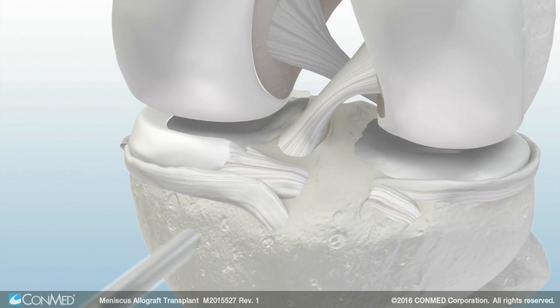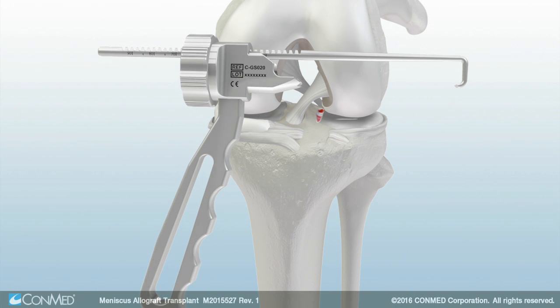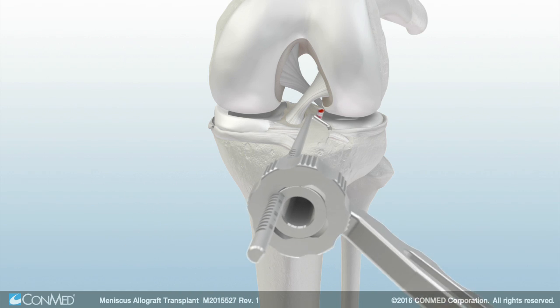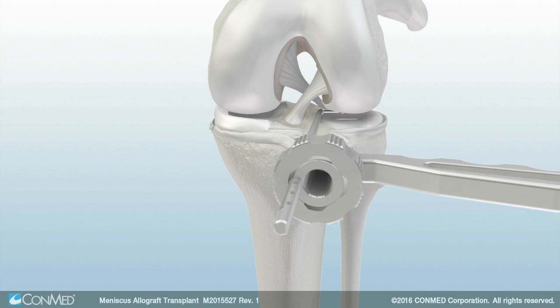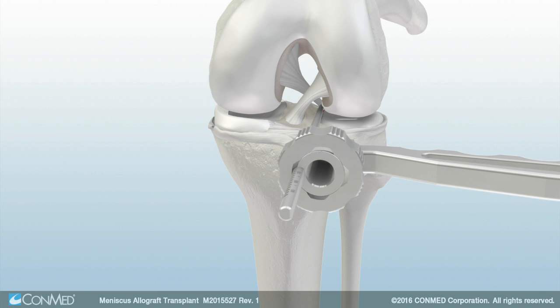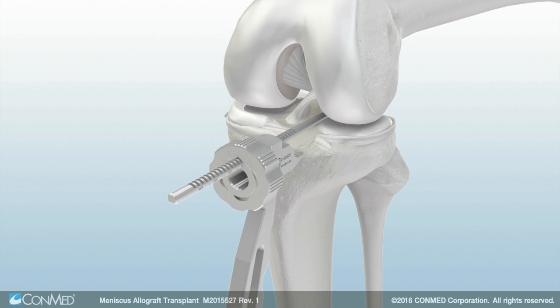Starting at the anterior horn, burr toward the posterior horn to create a shallow trough level with the tibial plateau. Then insert the drill guide into the incision vertically. Once inside the joint, rotate the guide horizontally to avoid damage to the articular cartilage. Once the posterior aspect of the tibia is reached, rotate the guide back to the vertical position and secure the guide's hook to the posterior cortex of the tibia. Rotate the tightening ring clockwise to secure the guide to the tibia. Next, insert the drill guide sleeve until the sleeve contacts the tibia. Lock the sleeve into place by rotating the cam lock.